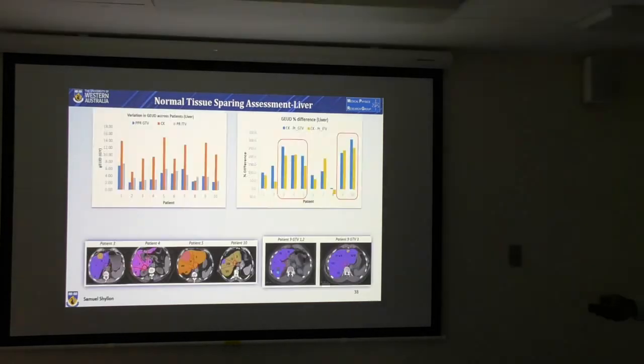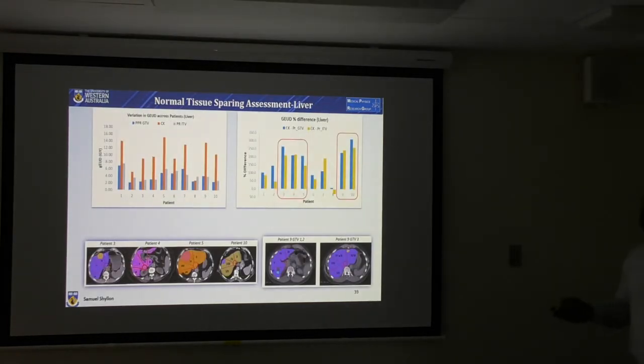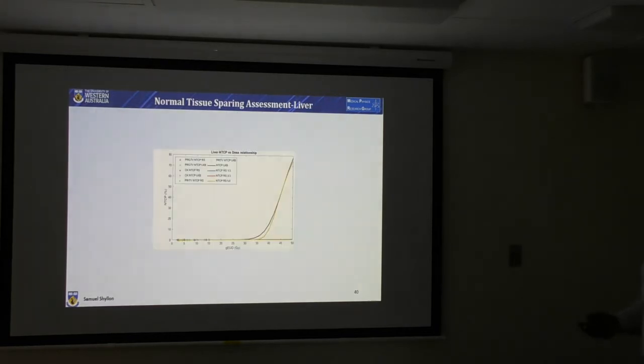and we look at the results for the generalized equivalent dose, we notice that patient 6 and patient 8 show the smallest difference between the proton and the CyberKnife plans. So that shows the effect of the amount of tissue that must be traversed by the proton plans. This suggests that patients with tumors located in such locations could represent a subset that will benefit the most from proton beam therapy.